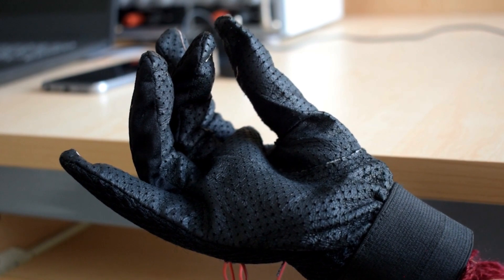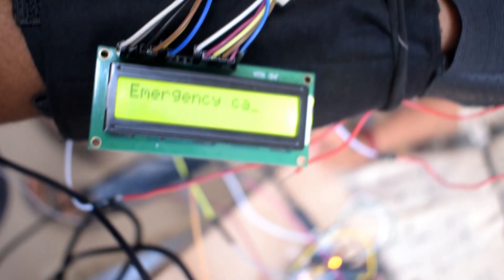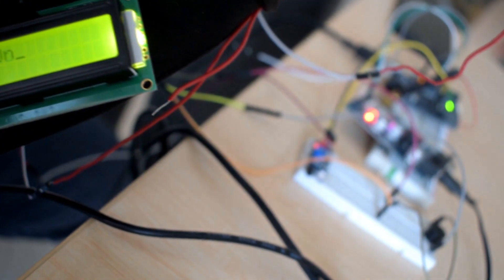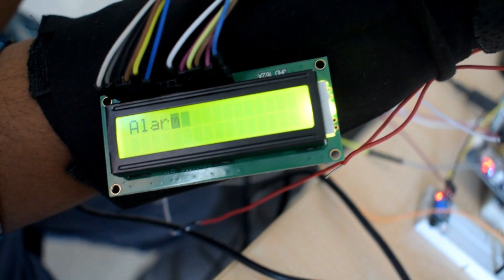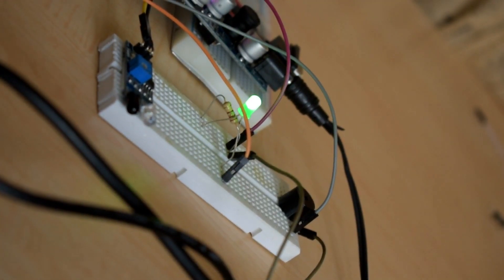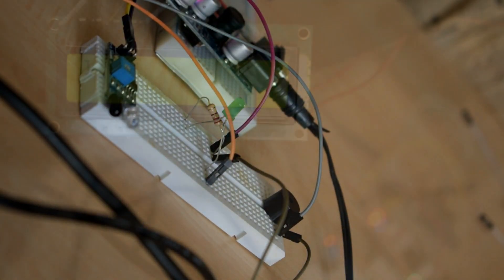The call to the guardian is performed by making the second finger contact the reference finger, and the emergency call is displayed on the LCD. We have implemented a theft alarm system — whenever a person passes by the sensor, the alarm sounds and 'Alarm On' is displayed on the LCD. With the first touch to the reference finger, the light turns on and 'Light On' is displayed on the LCD; the second touch turns the light off and 'Light Off' is displayed.